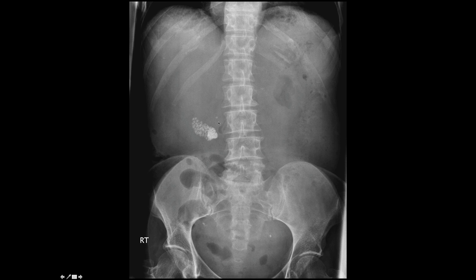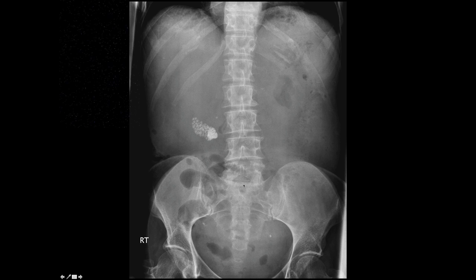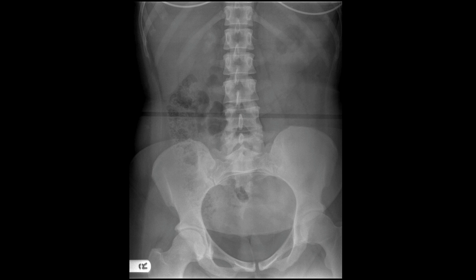The stone may be in the cystic duct or CBD, and in the clinical setting you'd need to proceed to ultrasound or CT. It's worth noting that gallstones are only opaque on plain film in about 10 to 15 percent of cases, so ultrasound is a better way of looking for gallstones. The bowel gas pattern here looks normal — very little gas in the large and small bowel.